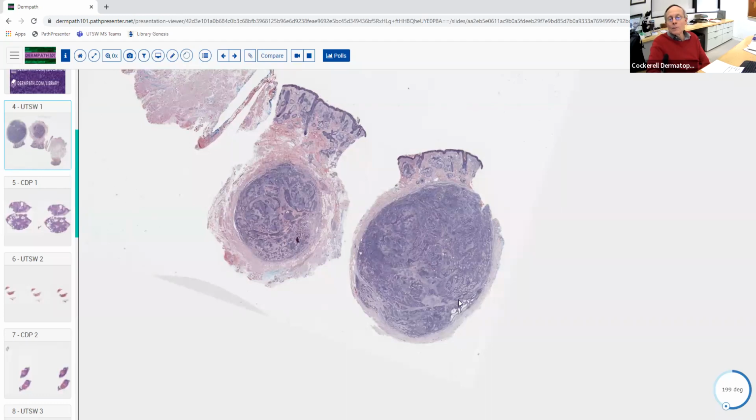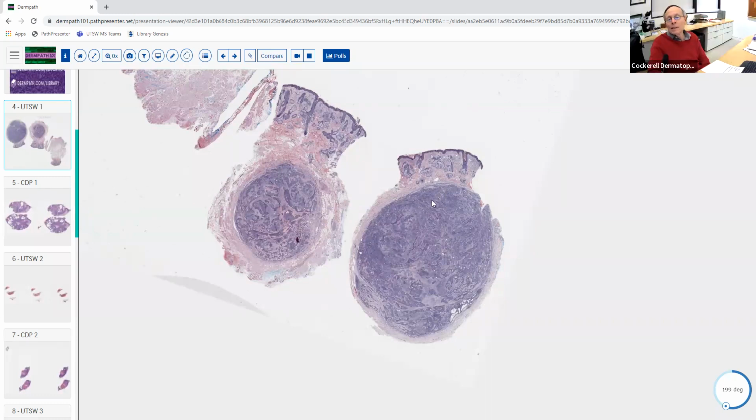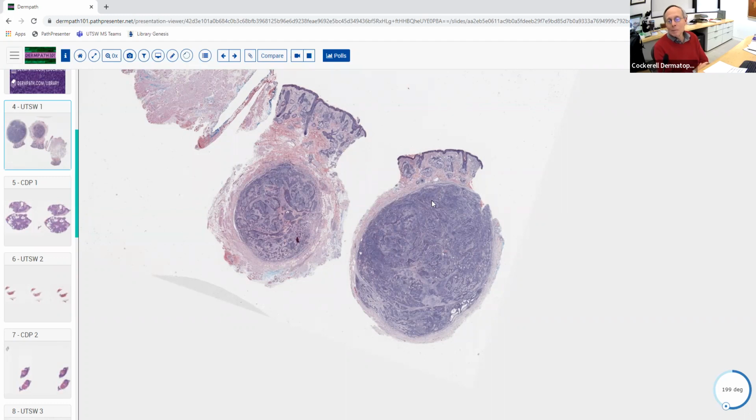Yeah, I agree. I think there you can tell. So probably it's going to be epithelial, right? Yeah. And here's the other part of it over here. You think it's benign or malignant? It's super well circumscribed. Yeah, exactly. If it's malignant, it's going to be like a metastasis or something unusual. So yeah, it's almost definitely going to be benign.